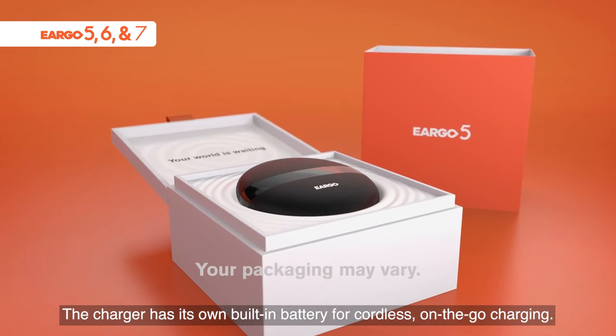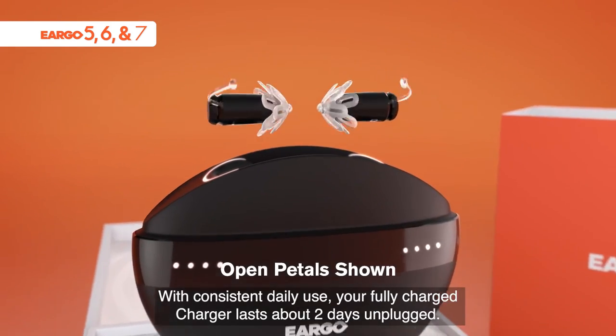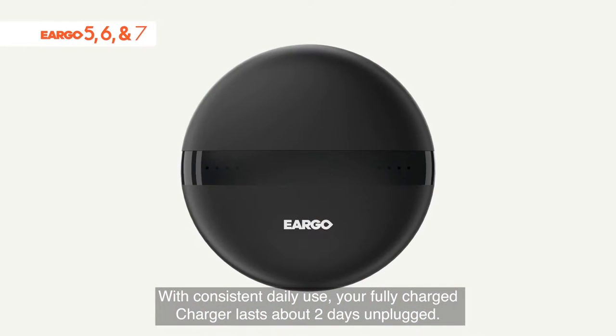The charger has its own built-in battery for cordless on-the-go charging. With consistent daily use, your fully charged charger lasts about two days unplugged.